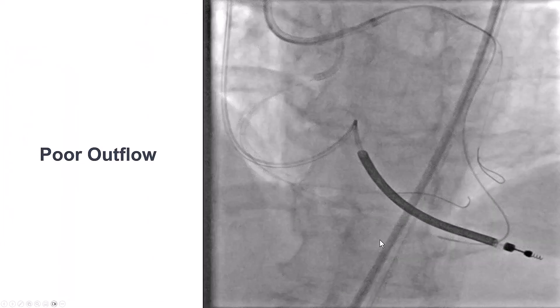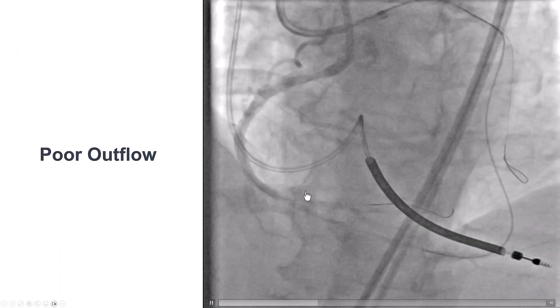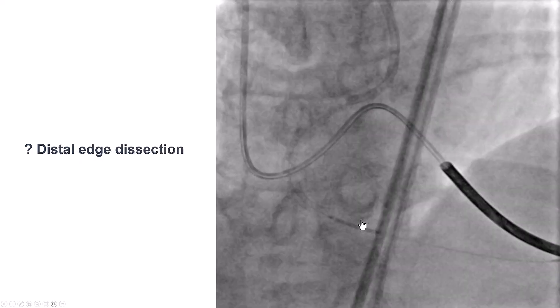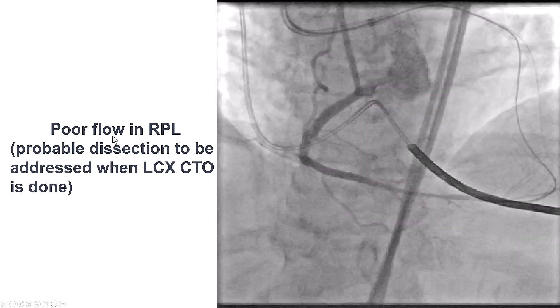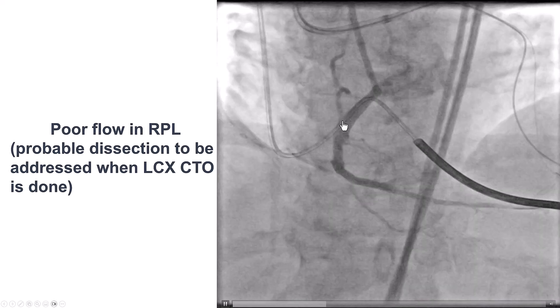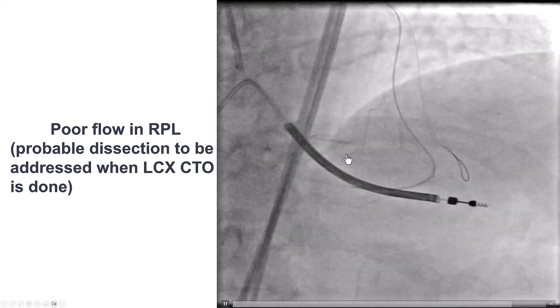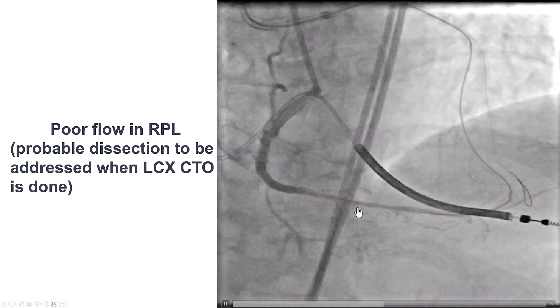We then placed a stent, but unfortunately had poor outflow. We had put a wire into what we thought was the posterolateral, but there was poor flow going into that vessel. Based on intravascular IVUS, we thought it might be due to dissection. We placed another stent, which gave excellent flow into the PDA, but not good flow into the posterolateral. We decided to stage this for later, as the patient was returning anyway for recanalization of the circumflex, and we could attempt the posterolateral at that time.